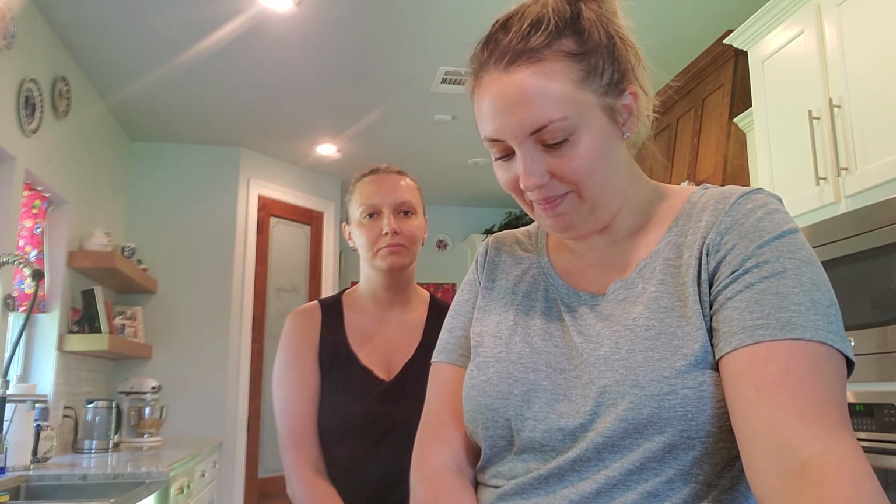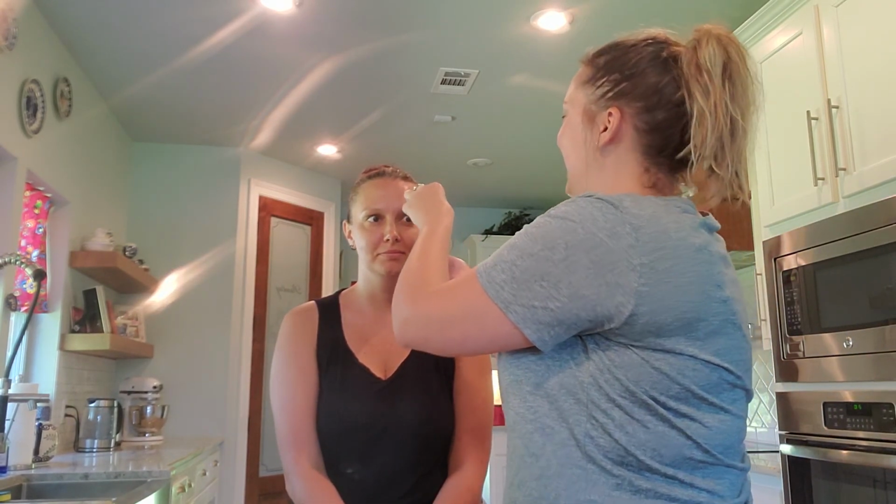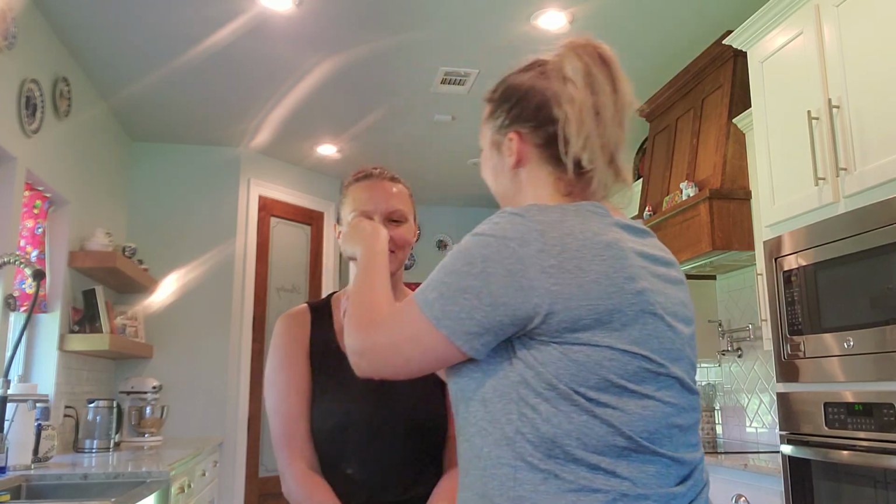Okay, now I'm going to inspect the anterior chamber. My patient is going to remain in the same position, and we're going to rotate the lens wheel slowly. We're going to rotate. Okay, the anterior chamber is transparent.